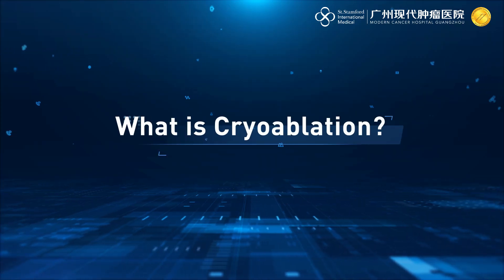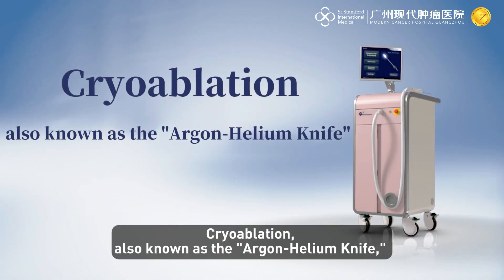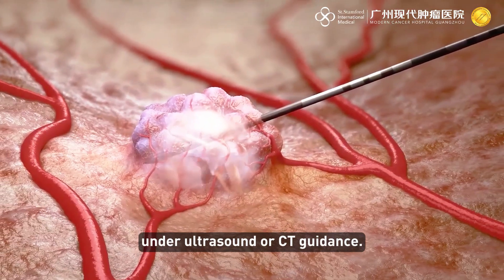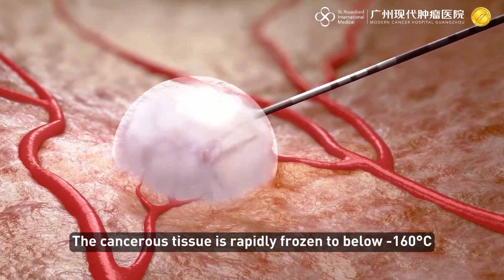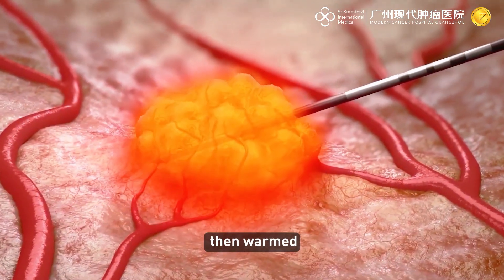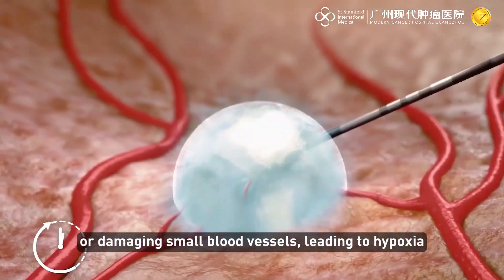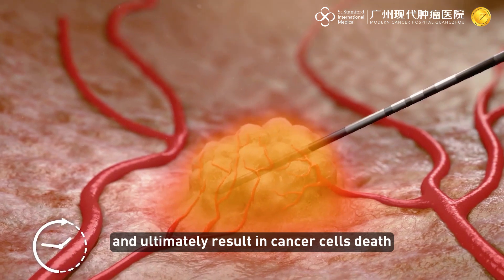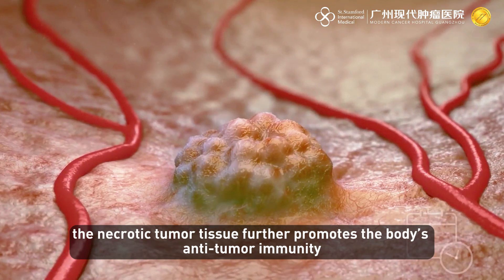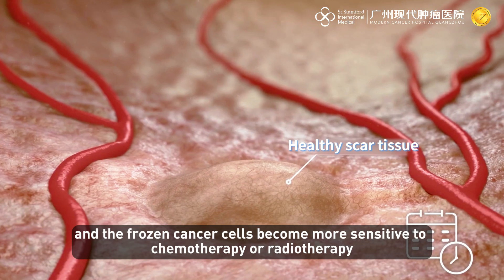Cryoablation, also known as the argon helium knife, involves inserting a cryoprobe into the tumor under ultrasound or CT guidance. The cancerous tissue is rapidly frozen to below minus 160 degrees Celsius, then warmed, causing dehydration and rupture of cancer cells, or damaging small blood vessels leading to hypoxia and ultimately cancer cell death. After cryotherapy, the necrotic tumor tissue further promotes the body's anti-tumor immunity, and the frozen cancer cells become more sensitive to chemotherapy or radiotherapy.